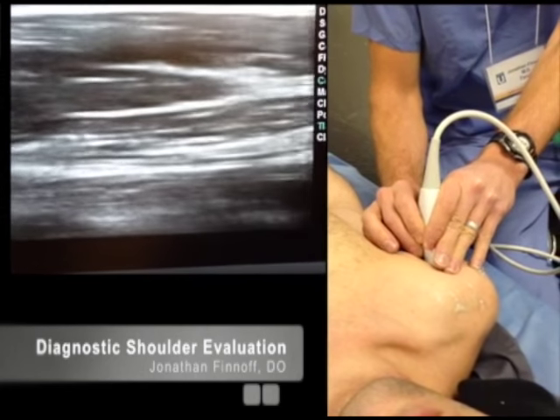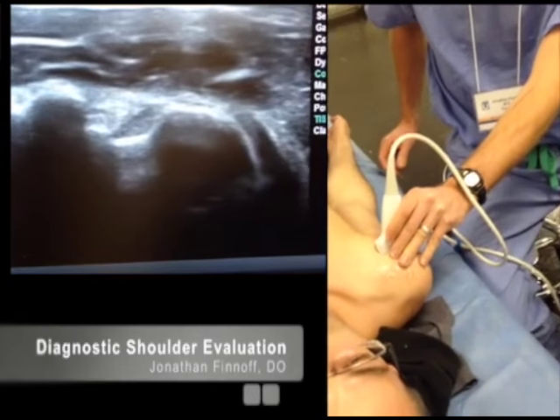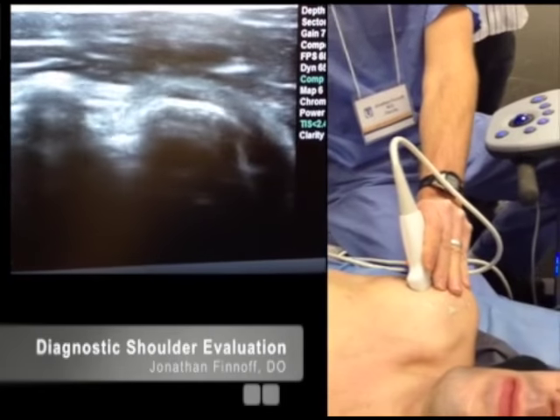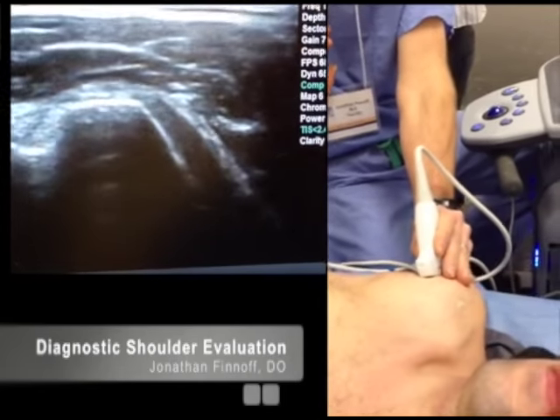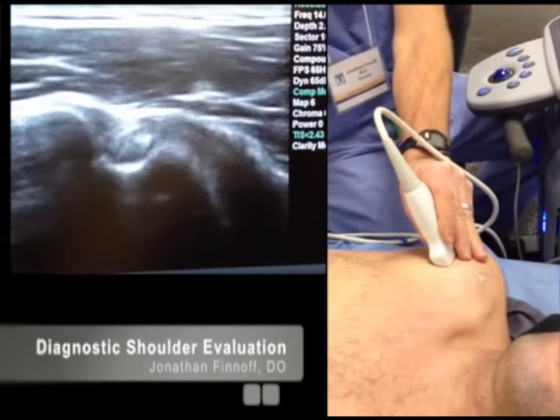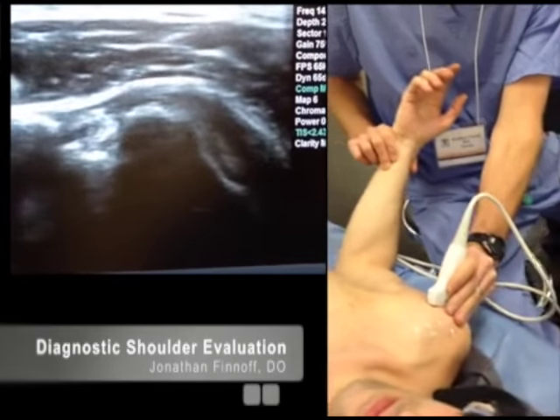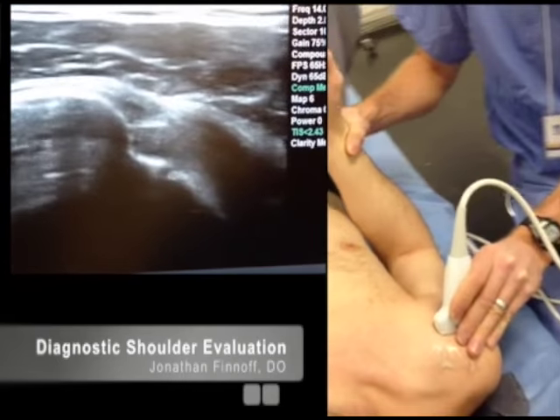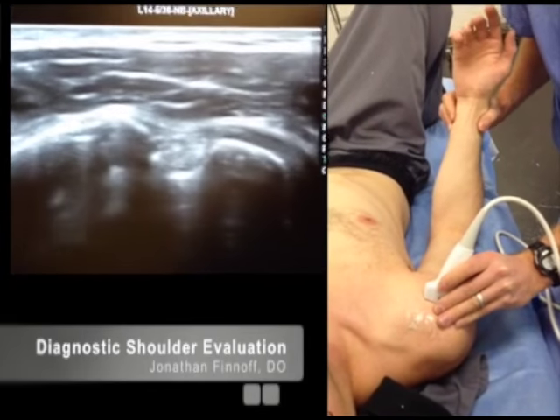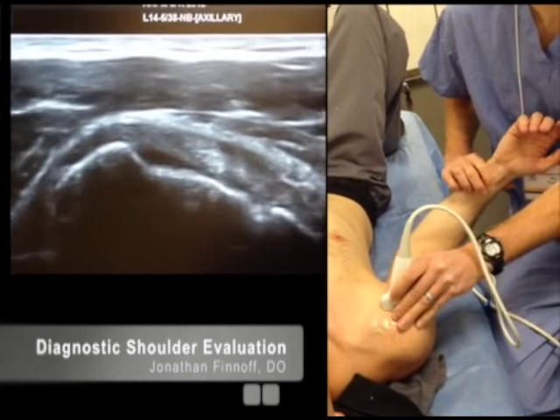After I've looked at it in short and long axis, I'm going to come back over the intertubercular groove and externally rotate while keeping the transducer centered over the top of that biceps tendon, then internally rotate. I'm going to look to see if the tendon subluxes or dislocates out of the bicipital groove — and his does not. After that, I'm going to externally rotate and move my transducer a little bit medial.